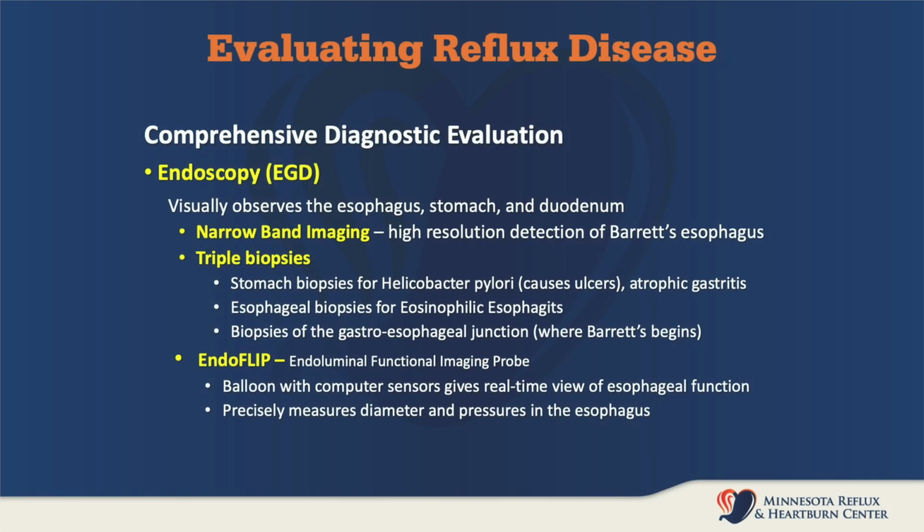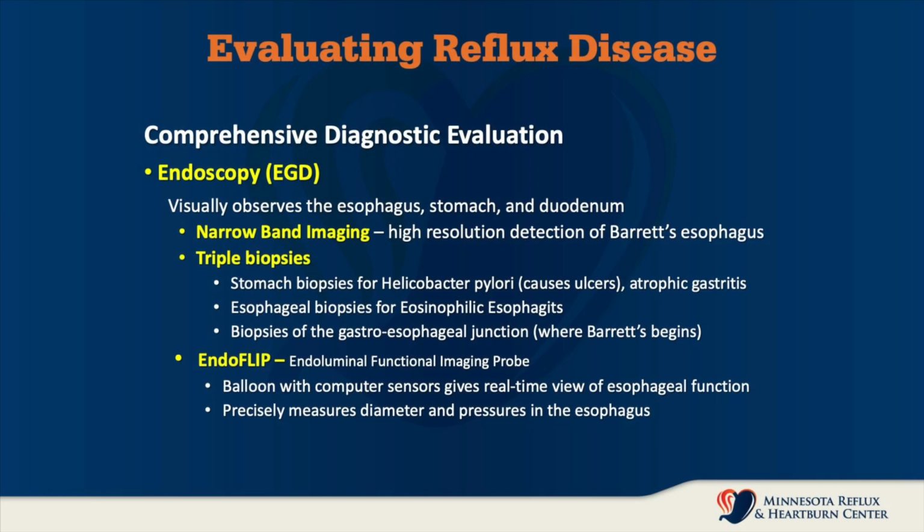I'll be talking with you today about the comprehensive reflux evaluation and all the diagnostics that go along with it. At the Minnesota Reflux and Heartburn Center, we like to do a comprehensive reflux evaluation. The diagnostics included in that are a variety, but the basic ones are usually an endoscopy, also known as an EGD or an upper endoscopy. This visually observes the esophagus, stomach, and duodenum.